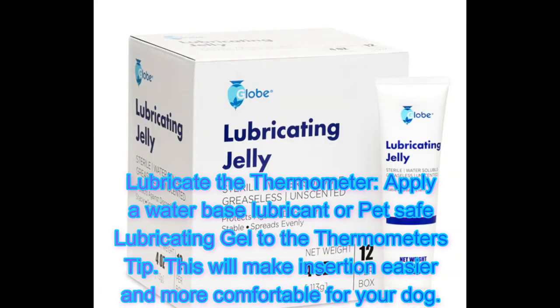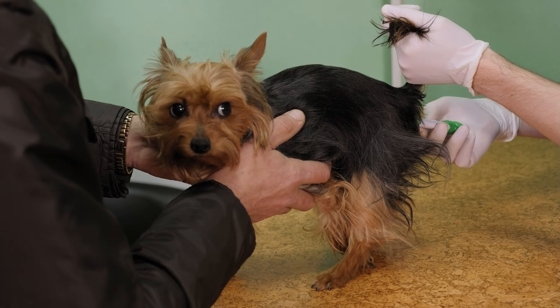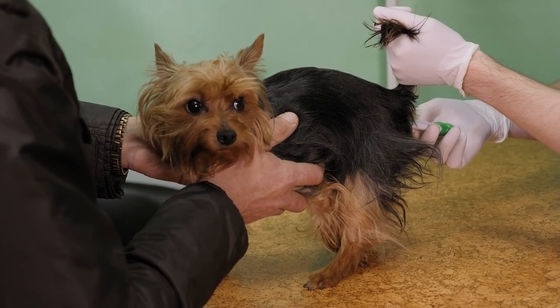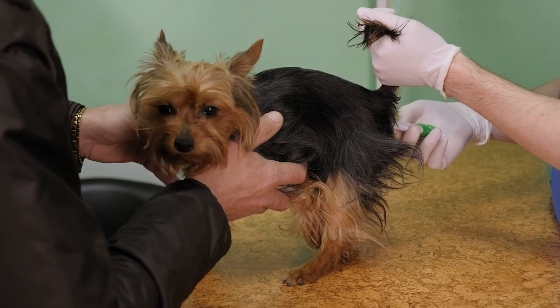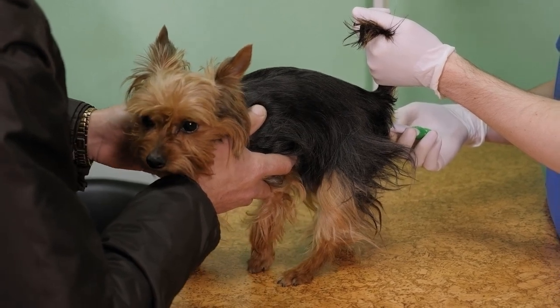Lubricate the thermometer. Apply a water-based lubricant or pet-safe lubricating gel to the thermometer's tip. This will make insertion easier and more comfortable for your dog. Lift the dog's tail. Gently lift your dog's tail to expose their rectum. Be sure to hold the thermometer firmly but not too forcefully to avoid injury.